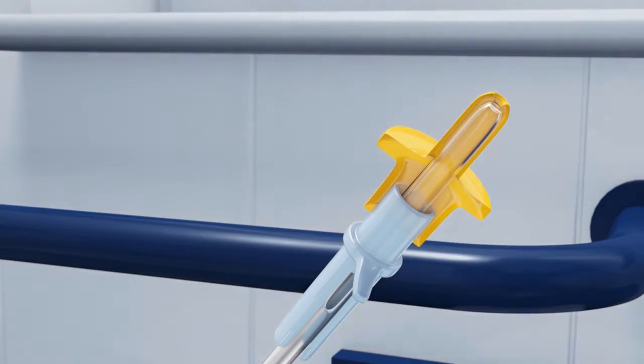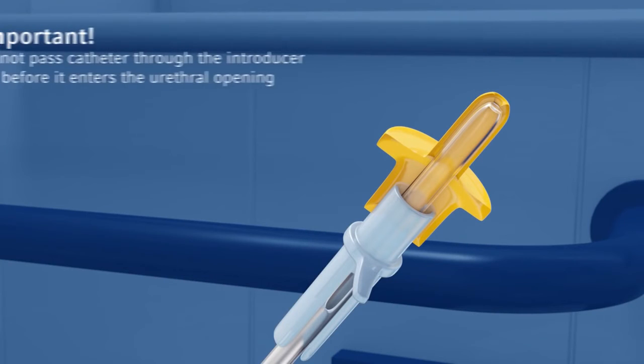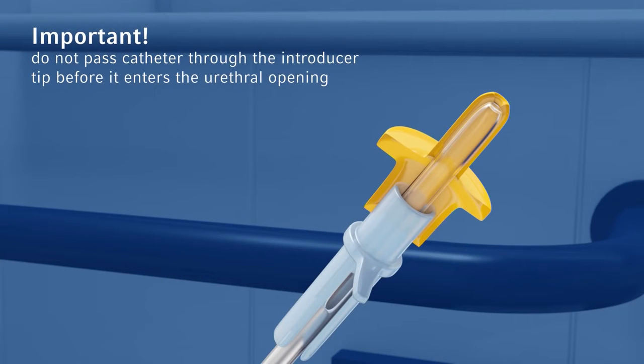The introducer tip is one of the main features of the MMG closed system for helping to reduce the risk of urinary tract infections. The introducer tip protects the catheter, allowing it to bypass the first 1.5 centimeters inside the urethra, where the majority of the bacteria reside. Therefore, it is very important that the introducer tip is inserted into the urethra the full 1.5 centimeters before you start advancing the catheter.